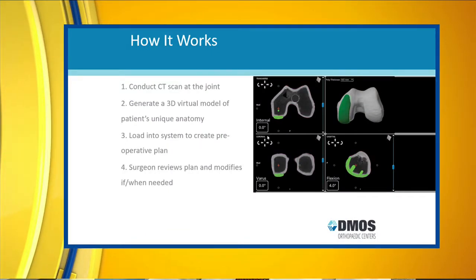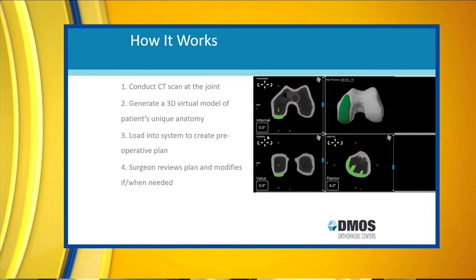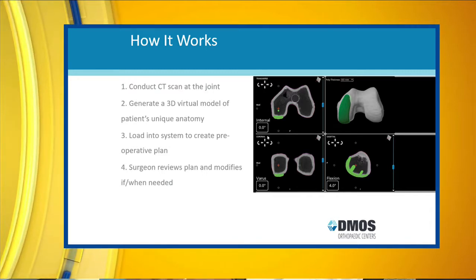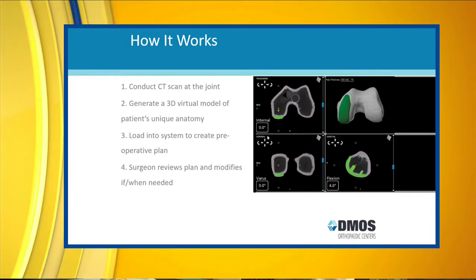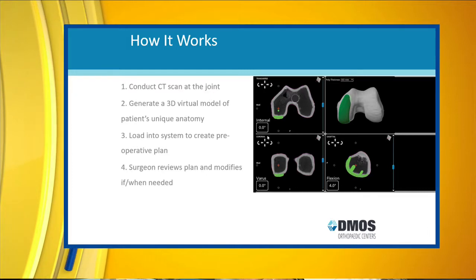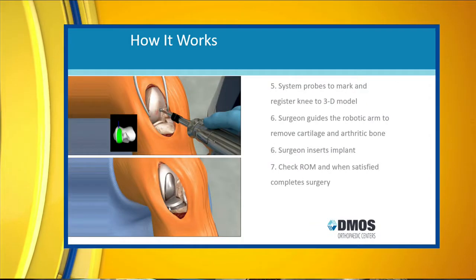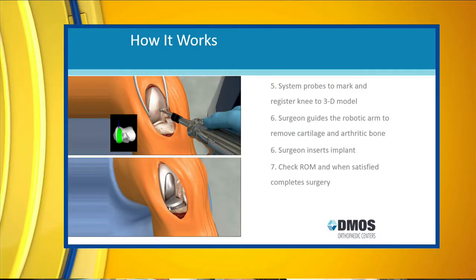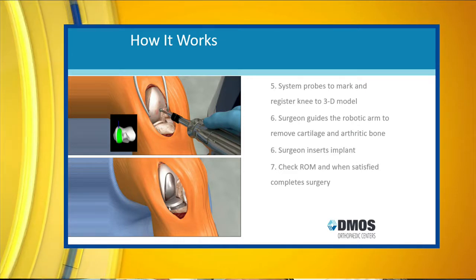Yeah, so you bring it into the position, and then the assistant that's running the robot for you tells it that it's armed or ready. And then once it's ready, you use this burr to remove the bone, but it won't let you draw outside the lines. So it's like painting in a coloring book, and it will not let you. So do you have like a tablet or something, or some kind of screen that you use to put pressure on where the robot goes?